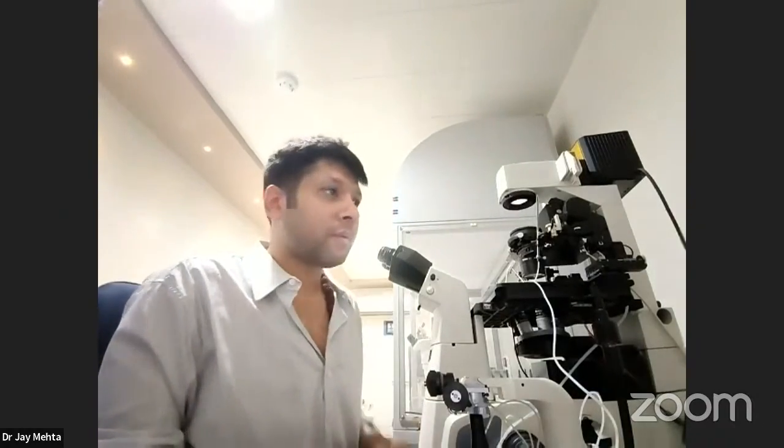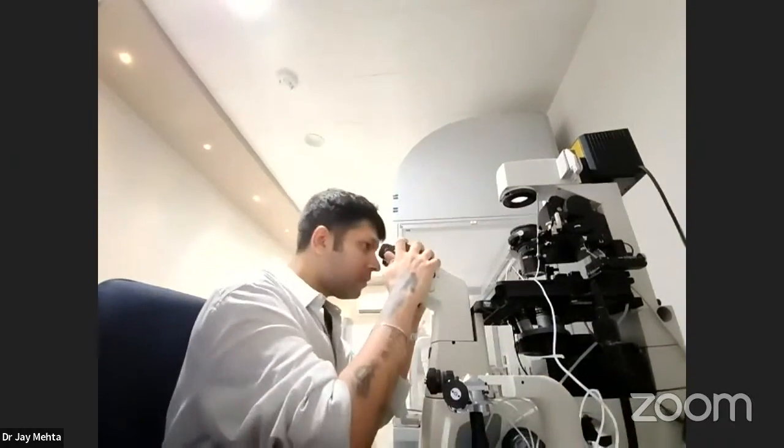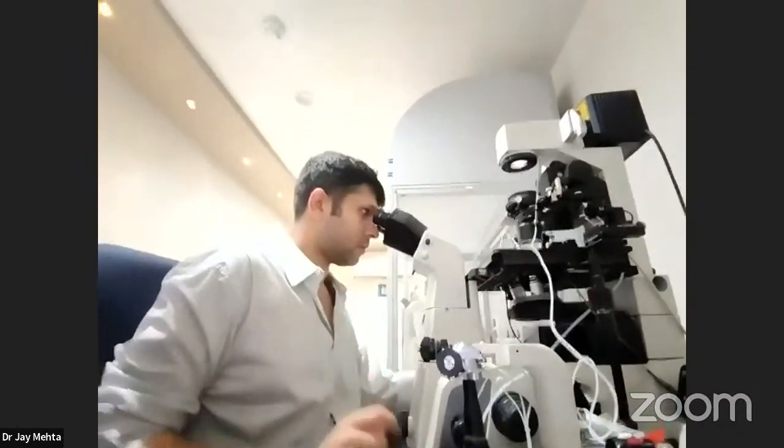And today's topic is extremely important as clinicians to know how to grade embryos. This is to make sure that the IVF clinics have good pregnancy rates, but at the same time reduce the chances of multiple pregnancies.